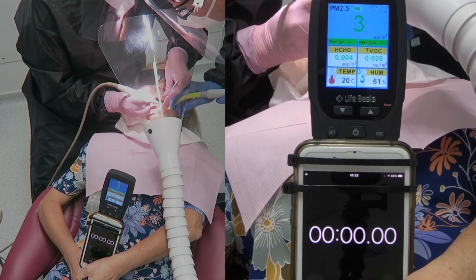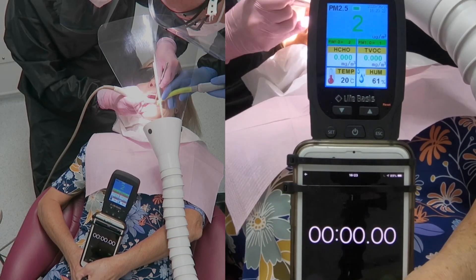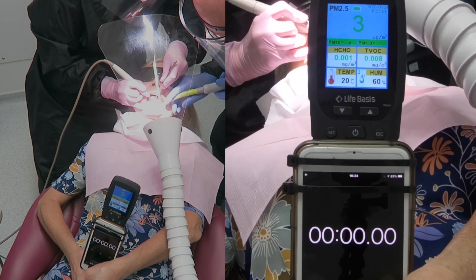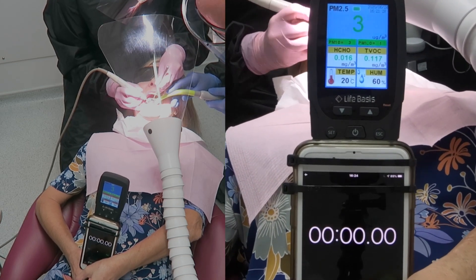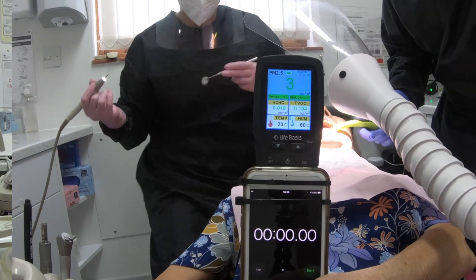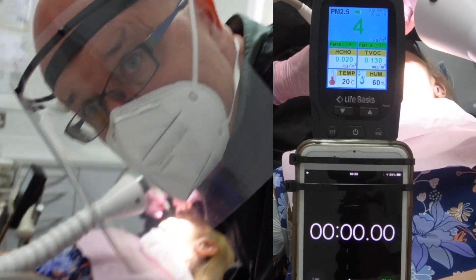Let's go. Here we go. Okay, we're just going to do the inside of the bottom teeth. I'm going to try and pick up the camera and see if I can show you the spray going up the tube here.